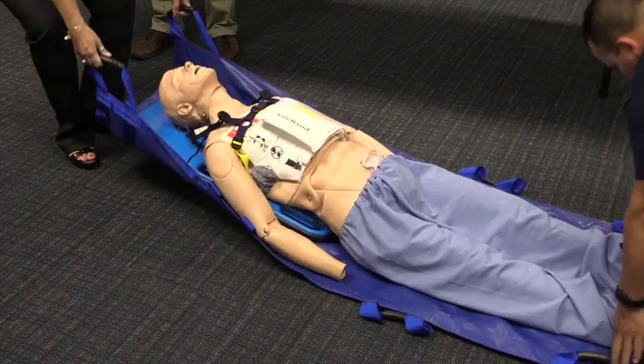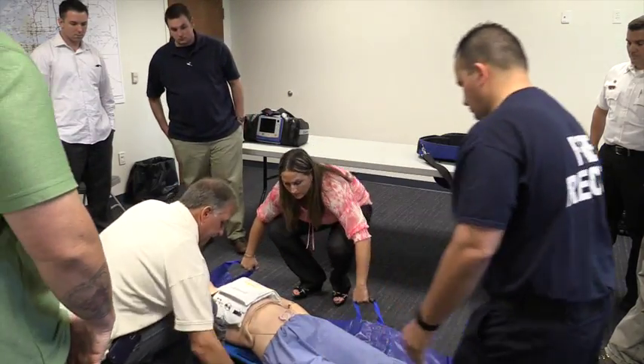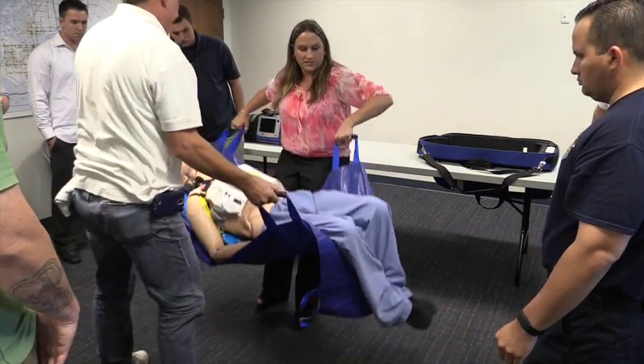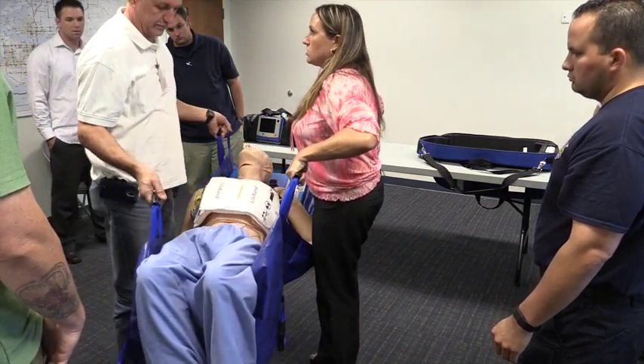It frees up a lot of people to do other things, providing pharmacological care. We don't have to take additional people to the hospital to rotate CPR — we don't have to do that anymore. It's going to really reach into the new best practices of EMS.